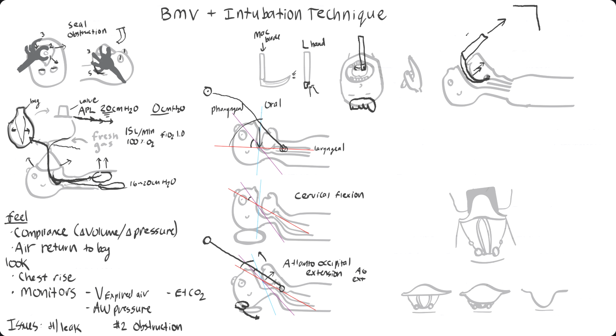What you don't want to do is rock this back. Do not do that because the patient will have upper teeth here, and you don't want these teeth to make contact with the metal blade. That would very easily cause dental damage, which we want to avoid. So after you've pulled on the laryngoscope, hopefully this is all displaced and you'll get a good line of sight.